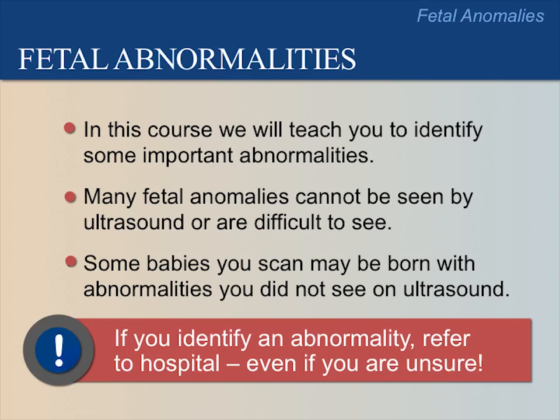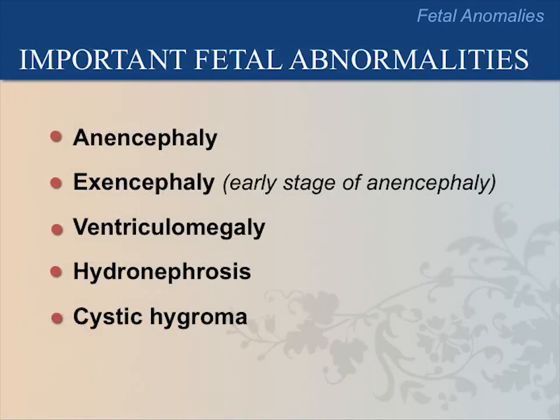If you identify a fetal abnormality, always refer to the hospital, even if you are unsure. It is more important to make the right referral than the right diagnosis. These are the abnormalities which we will discuss in this lecture.